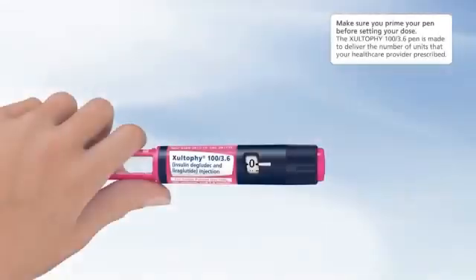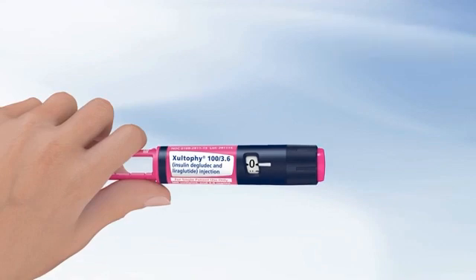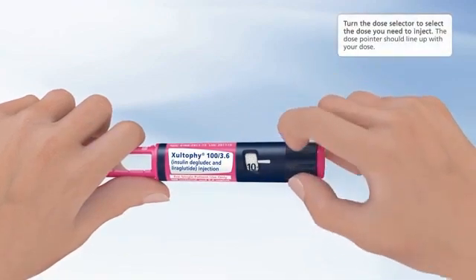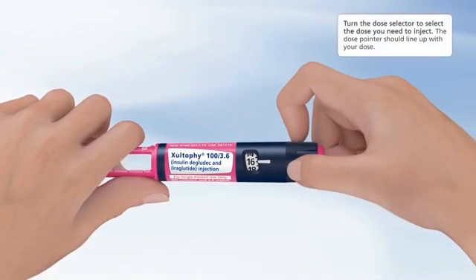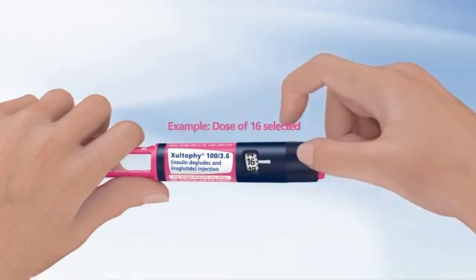Selecting your dose. Make sure you prime your pen before setting your dose. The Zultify 100 3.6 pen is made to deliver the number of units that your healthcare provider prescribed. Take your dose exactly as your healthcare provider tells you to — do not change your dosing schedule without first talking to your healthcare provider. Turn the dose selector to select the dose you need to inject; the dose pointer should line up with your dose. In this example, a dose of 16 is selected.